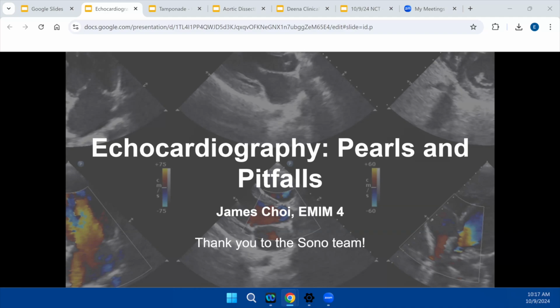You guys know I'm obsessed. And just a little thing before we start the lecture. We're all really bad at echo. Just know that. And this is a way for us to try to get a little better at the echoes. Right? We're better than the cardiology.